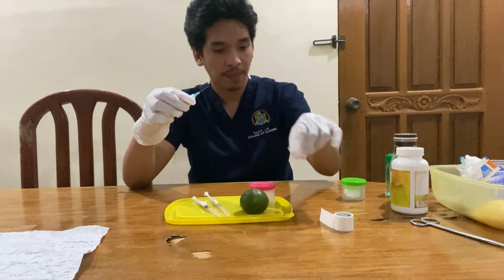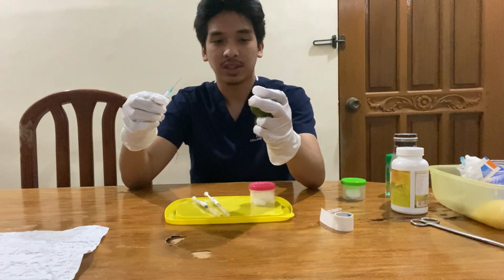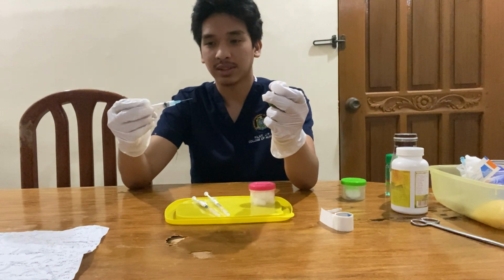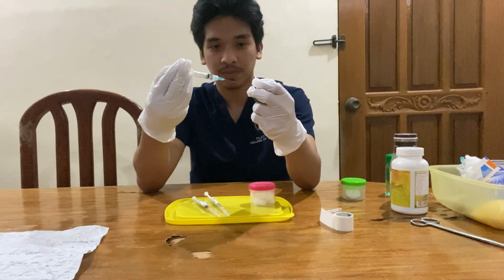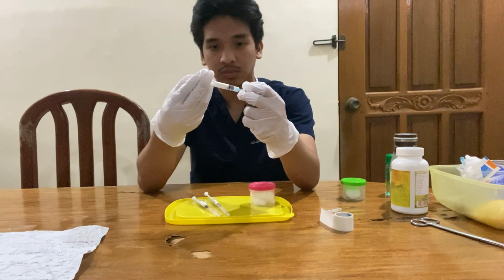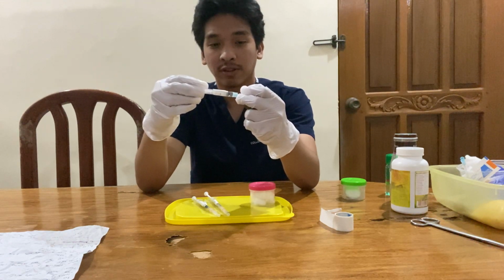Remove the cap and perform the Z-track. You retract the skin, press it like that, and then now we're ready to inject. And then we will wait for 5 to 10 seconds.